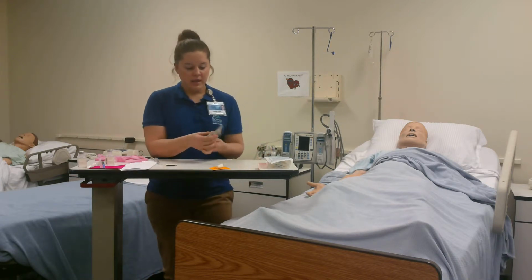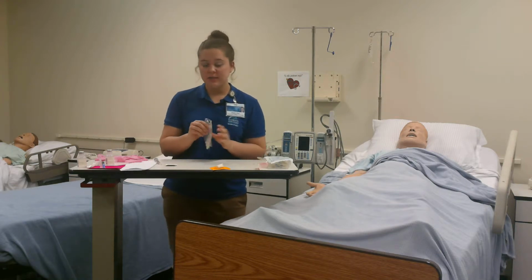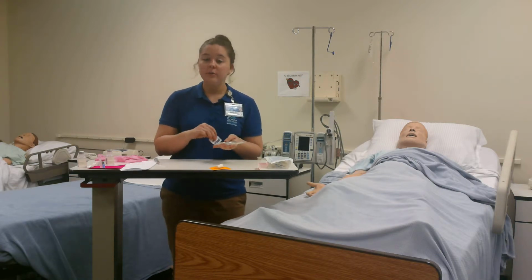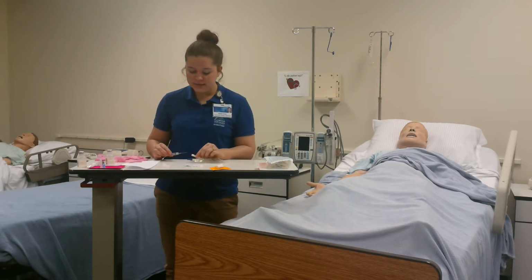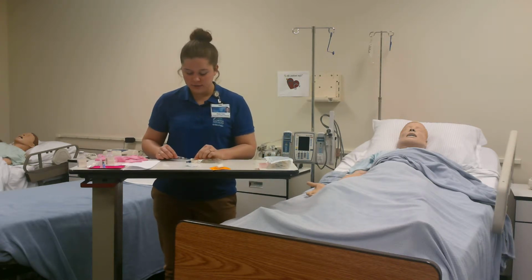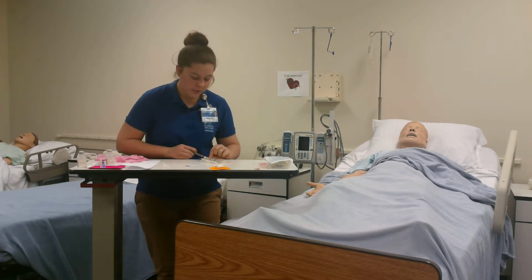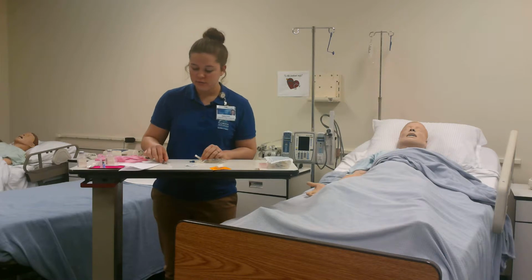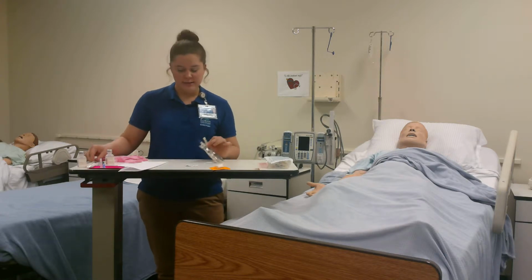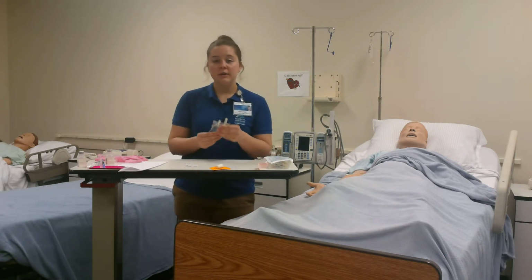Okay, and I have my 50 milliliter bag of saline, and we're going to want to clean off the port, proper aseptic technique, and we're going to infuse our medicine into the port. Into the bag. 1 milliliter of vancomycin added. We're going to properly dispose of our needle, and we would not typically recap needles. And we're going to infuse the bag.